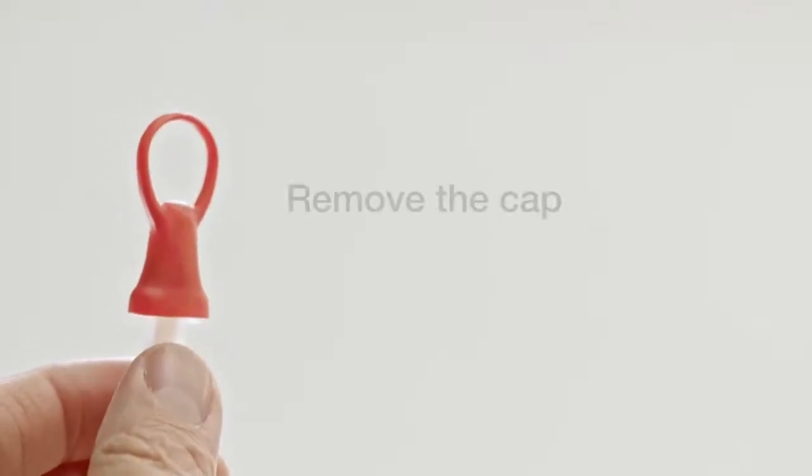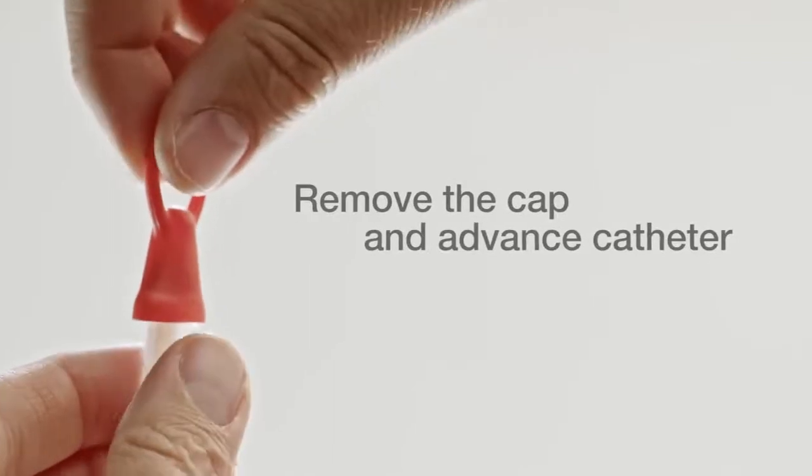To continue, remove the cap. Hold the catheter in one hand and with the other hand, advance the catheter forward until the tip of the catheter fills the protective tip, taking care that the catheter does not protrude.